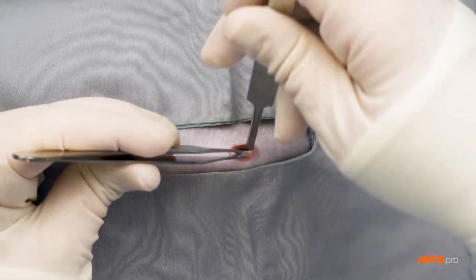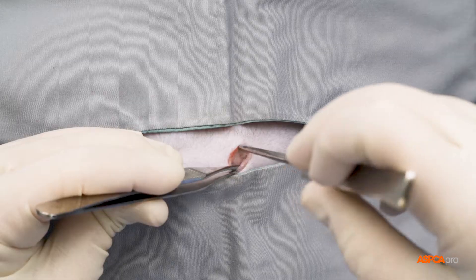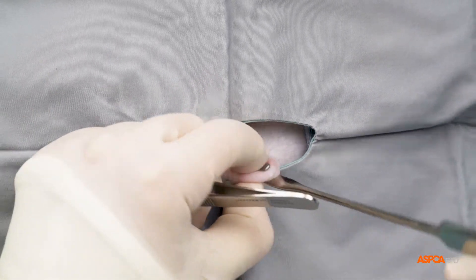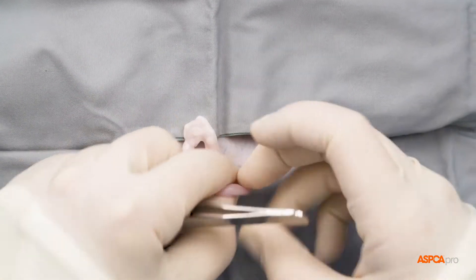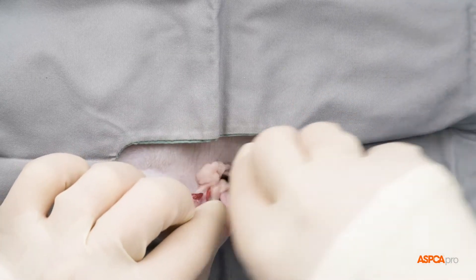A spay hook is now used to carefully sweep across the inside of the abdomen. It is used to pick up either the uterine horn or the broad ligament, which is attached to the uterine horn. The ovary can now be pulled through the incision opening. Any extra tissue is placed back in the abdomen.